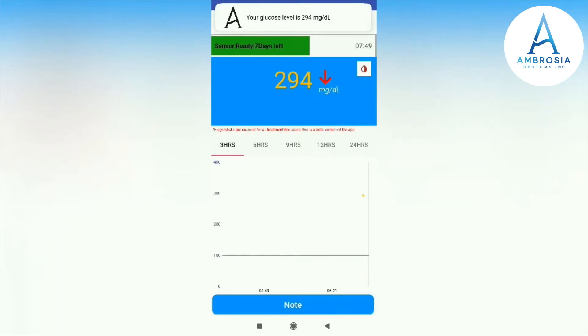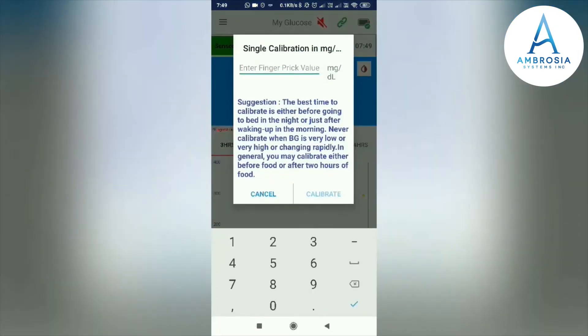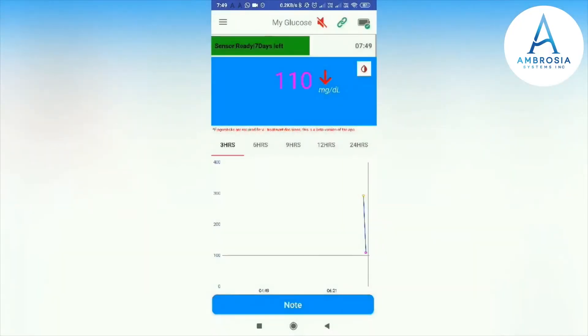Your LinkBlueCon app is now connected to your Night Rider. The scanner is showing seven days left. I recommend adding a calibration reading in mg/dL. You can use a finger-prick test to get your glucose reading and add it to the LinkBlueCon app to calibrate. I have added 110 mg as my calibration glucose in the app.